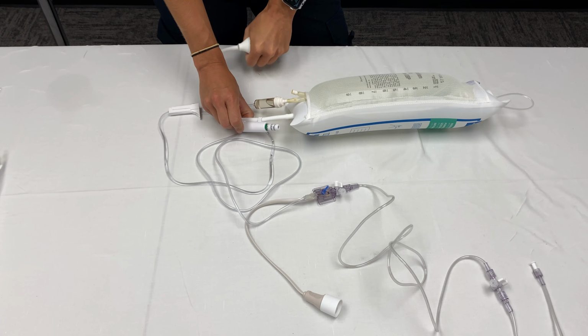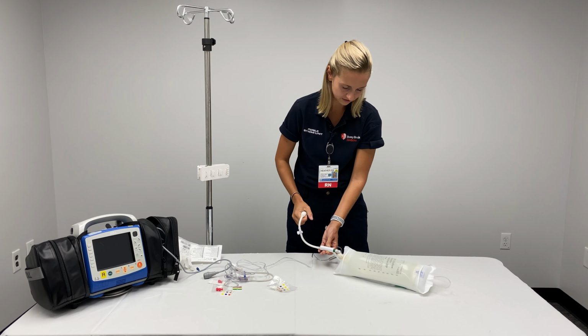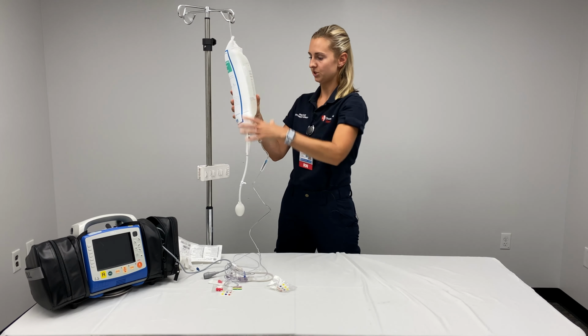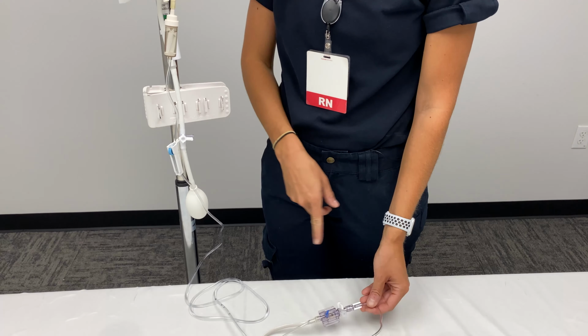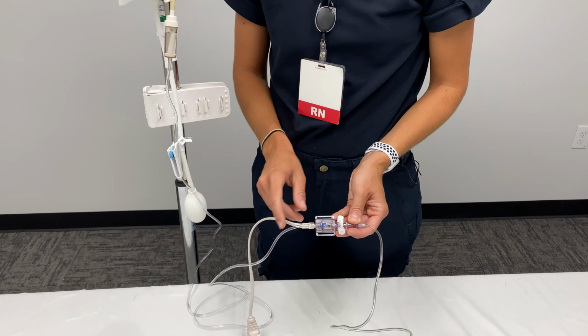So there's the green. And I go right until you just see a little bit of red, because when you flush your line, you do lose some pressure. So next you're going to flush out your entire line, making sure that you're free of air. You're going to start at the first main port.